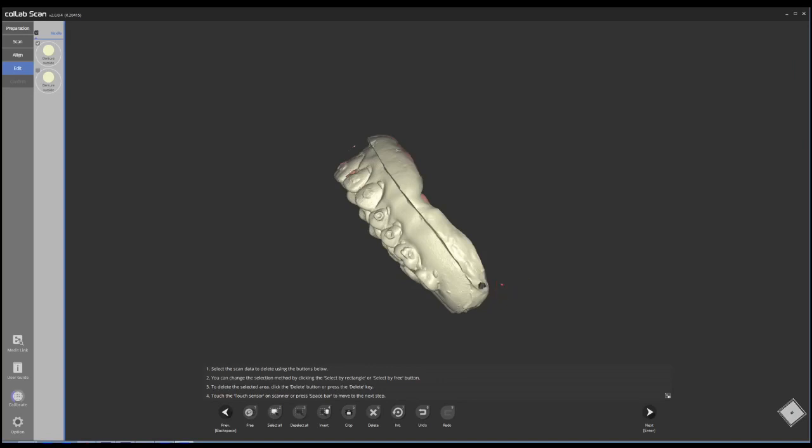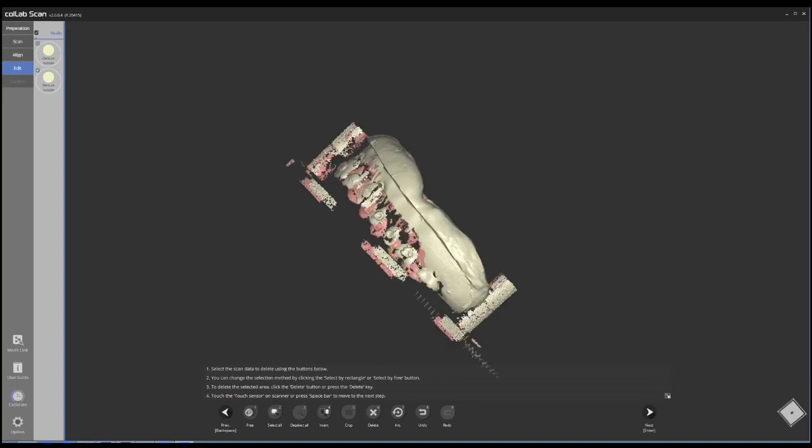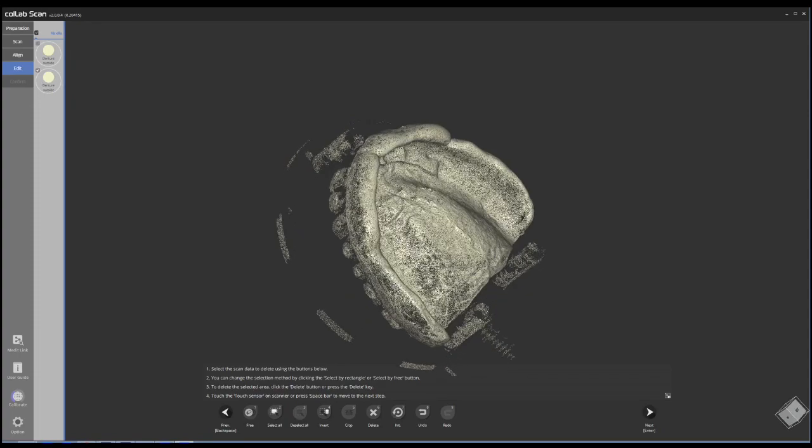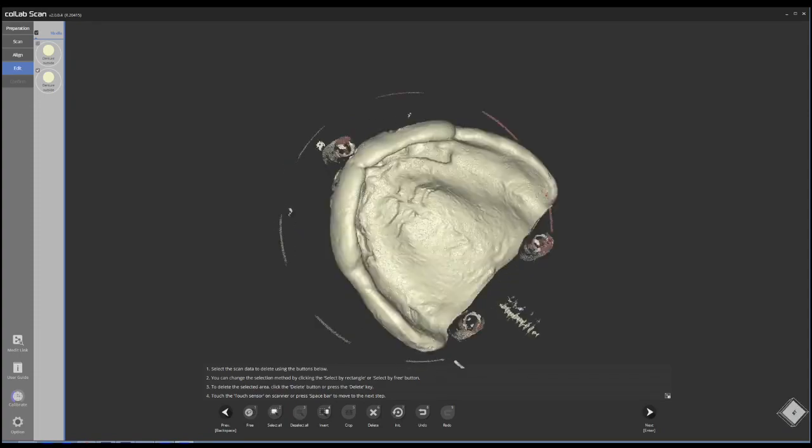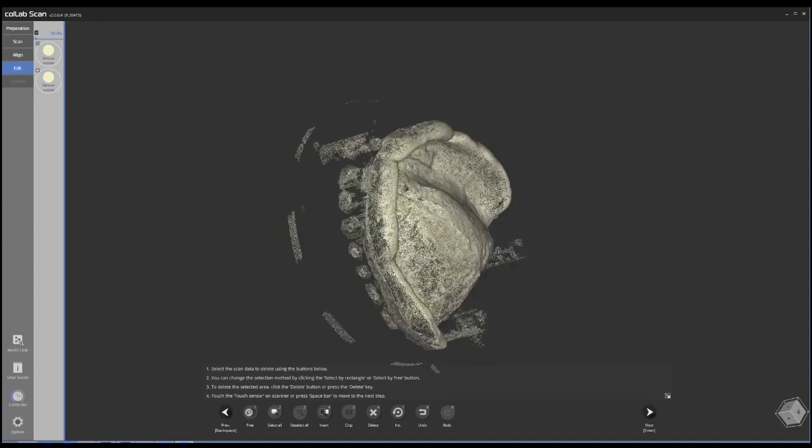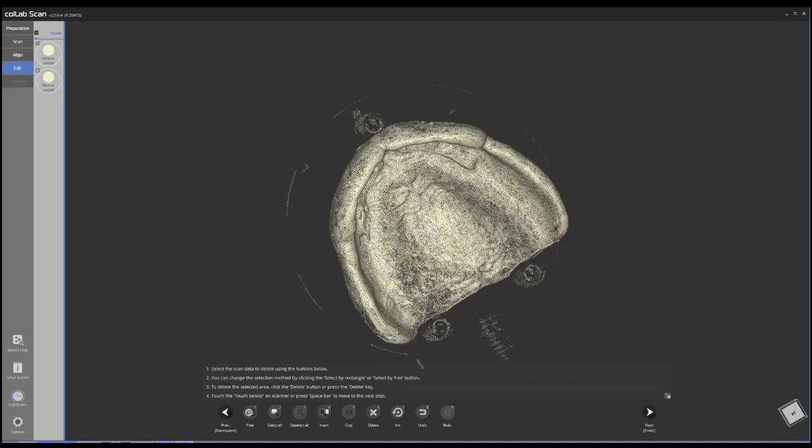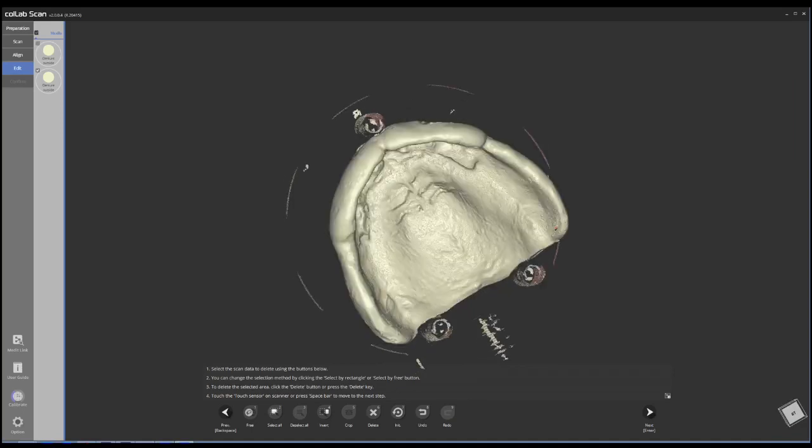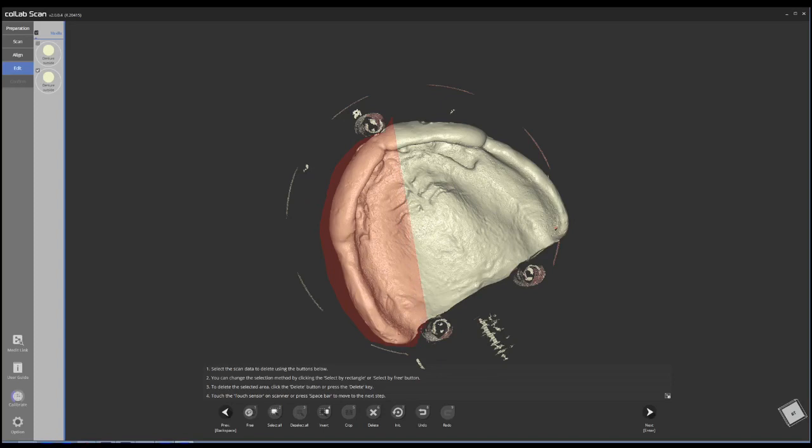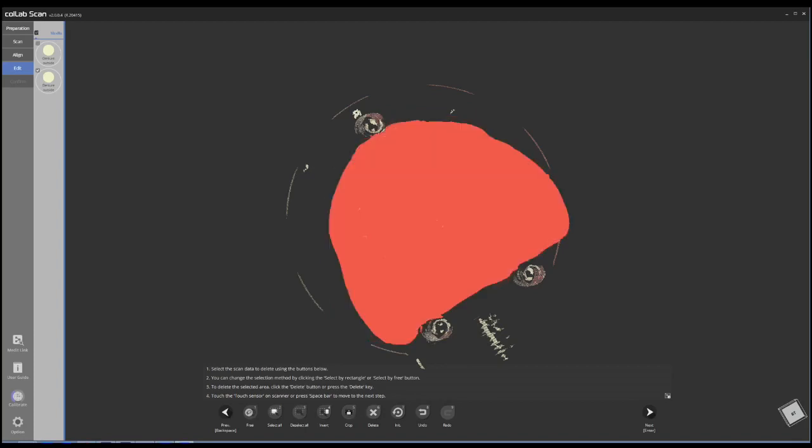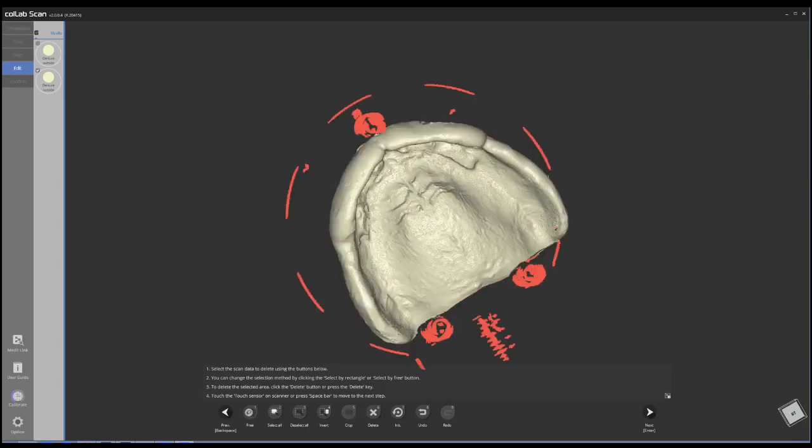In this case, I'm going to switch to the inside part of the denture and do the same thing. I'm going to use the lasso tool, basically go all the way around the denture, and then just select the denture itself, click crop.